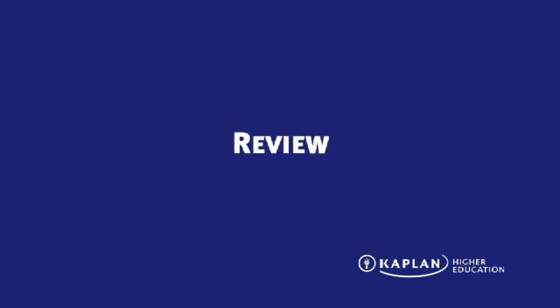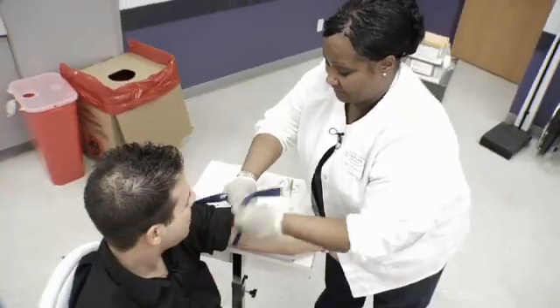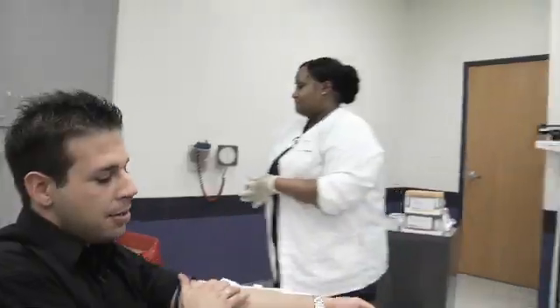Do your best. You're not going to always get it every single time, but do your best to make that patient as comfortable as possible. Explain what you're doing to the patient in terms they can understand. You've just seen how to do a basic venipuncture procedure. Remember these key elements: always check the doctor's orders, greet the patient, wash your hands before the procedure, clean the site in a circular motion, always have your equipment assembled prior to the procedure, ask the patient about latex allergy, never leave the tourniquet on for longer than 60 seconds, and always discard your needle in the sharps container. Relax, take your time, and pay attention to what your instructor is telling you.